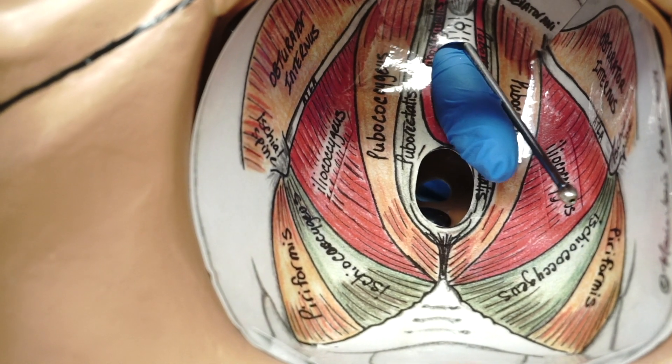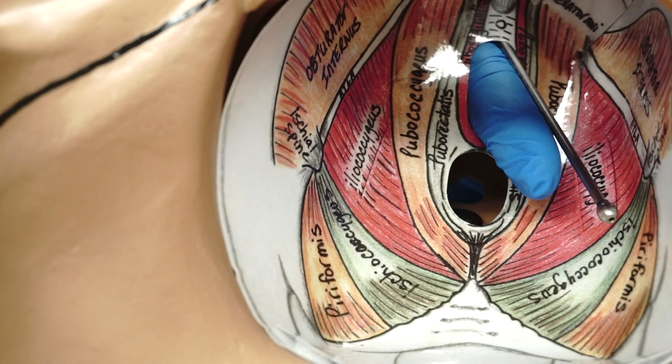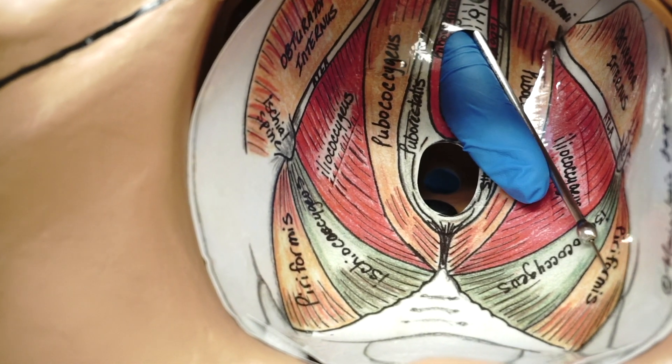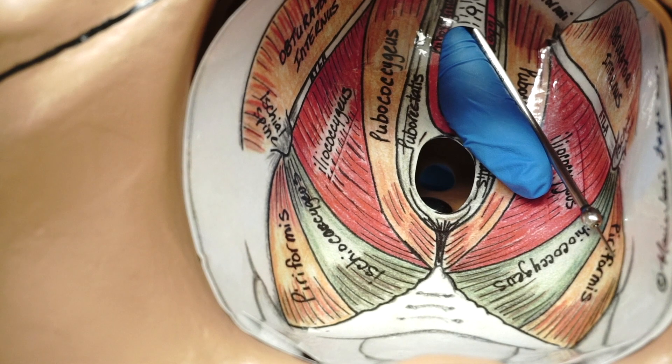The piriformis muscle is quite deep in the pelvis and requires pushing and hyperextension of the patient's leg. The piriformis muscle is then injected with solution.